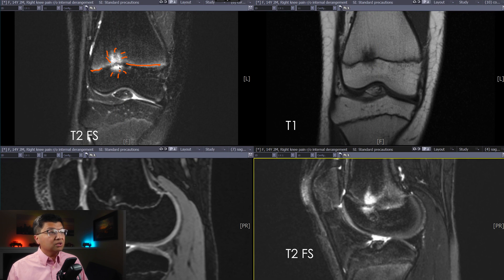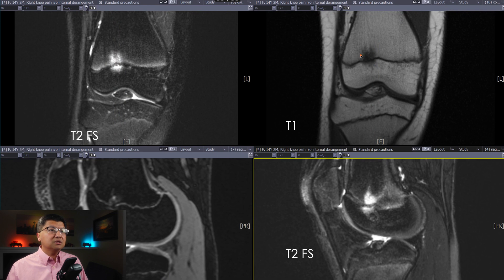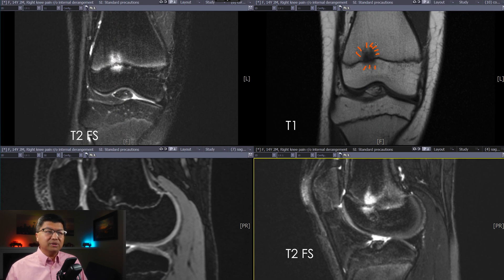It's focal and it's periphyseal. That same area on a T1-weighted sequence looks dark because what the fluid is doing now is replacing the fatty marrow, which is white. That's why this part appears dark on the T1-weighted sequence.